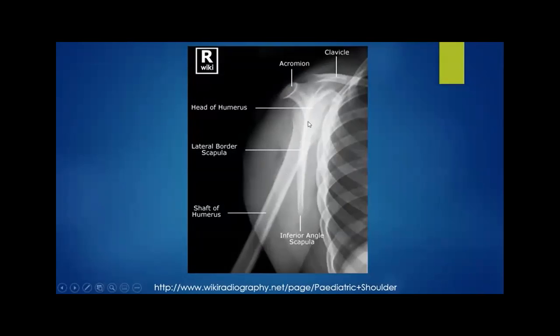This is off of wiki radiography. Usually they are good x-rays, but this one looks more like not for the shoulder, but for the scapula picture. So I think we just might need to fix that. We'll look at it in our book and talk about it more.